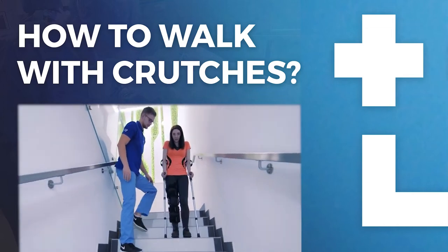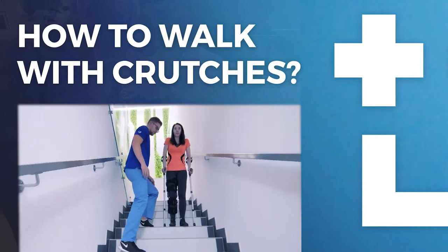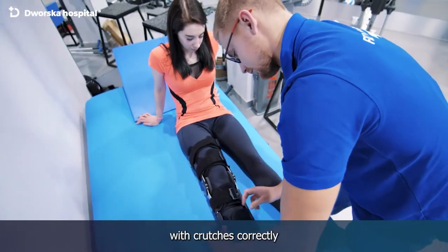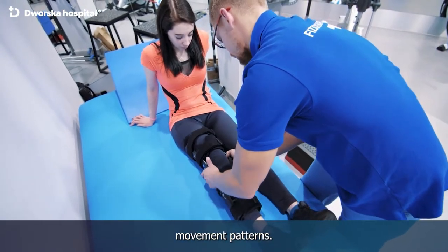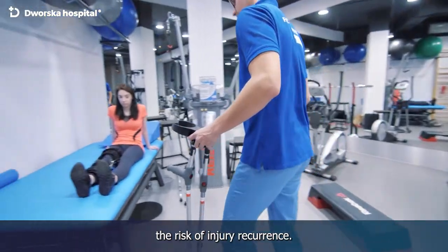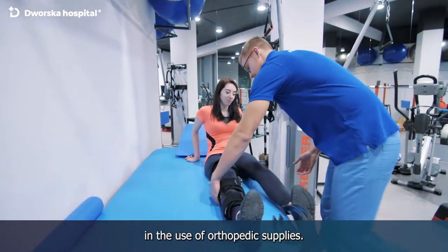In this instructional video we would like to show you how to walk with crutches properly. Many patients can't walk with crutches correctly after an injury or surgery. It can lead to abnormal movement patterns and can also increase the risk of injury recurrence. Our mission is to educate patients in the use of orthopedic supplies.